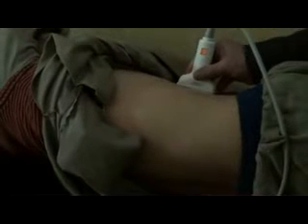Now to see the fundus, I have to rotate the probe about 30 to 40 degrees and then angle it wherever I get the accurate picture for me to depict the pathology. Now if not, then ask the patient to take a deep breath and hold it. You will get the total picture of the gallbladder.